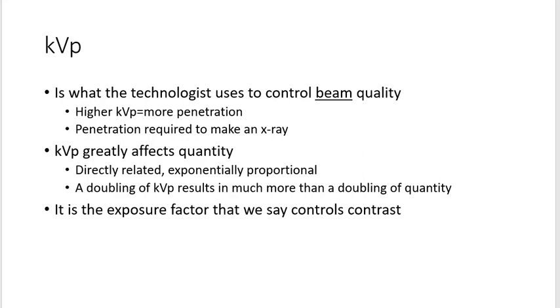So kVp affects the numbers, and it affects the numbers directly, in that if you increase your kVp, you increase your numbers, but it changes the numbers directly and exponentially.